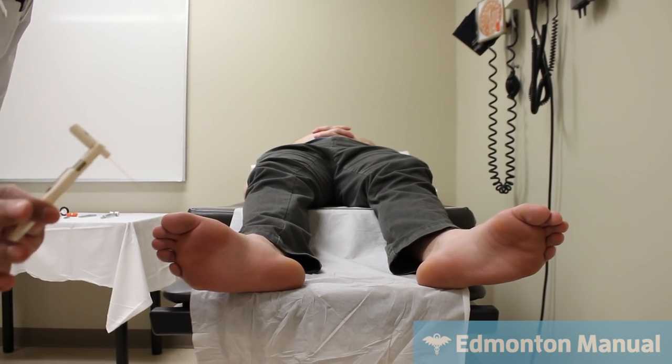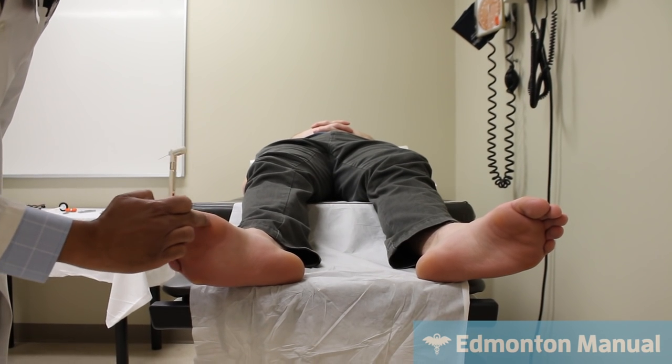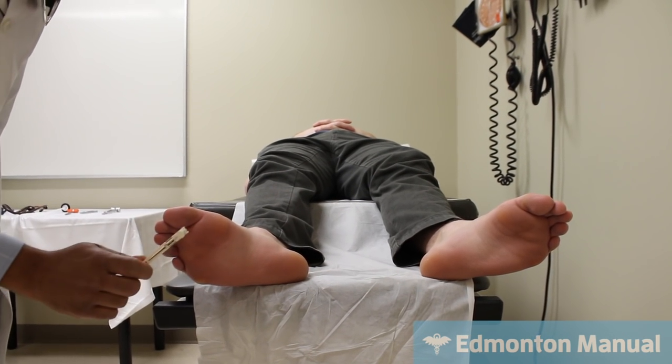Okay, and that's interesting. I intentionally did that because he actually has a callus right here. And that's one of the key points: you should not do it right over a callus.